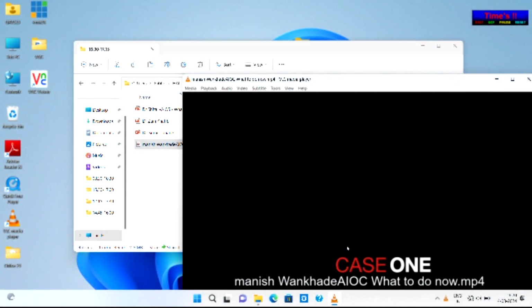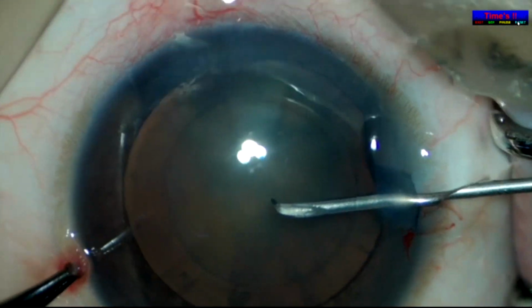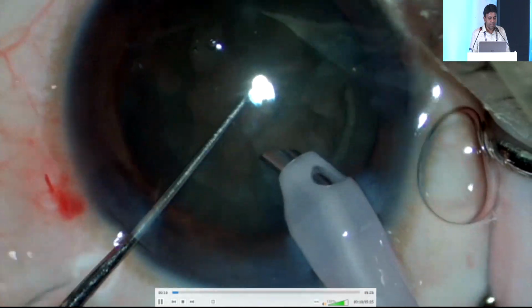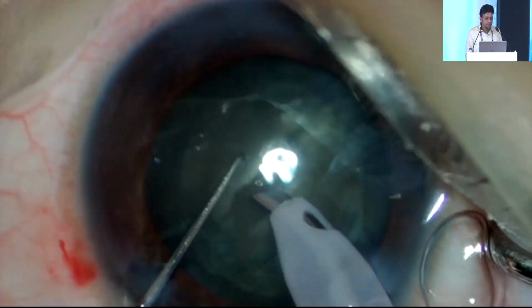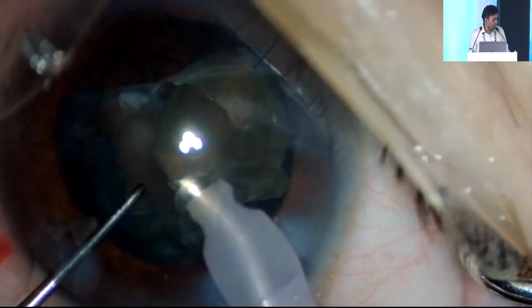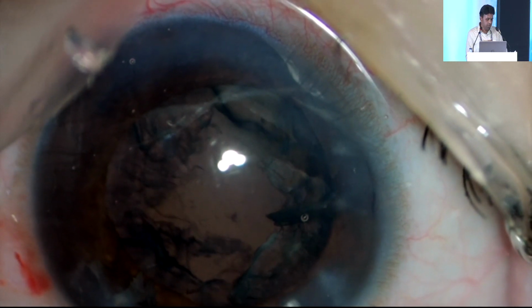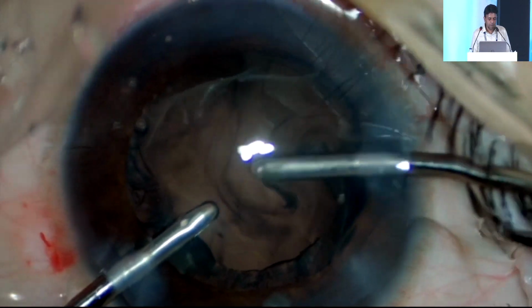Yes, go ahead. Thank you very much for this golden opportunity to present in front of all these stalwarts. Today I will present a simple few cases of cataract surgery which we practice day-to-day. This was a simple dense cataract. Everything was going on normal. I did the Rexis, dense NS3 cataract, normal direct chop technique, and there was nothing in my mind until this step. Even we can see when I put the viscoelastics, the AC was very well formed.